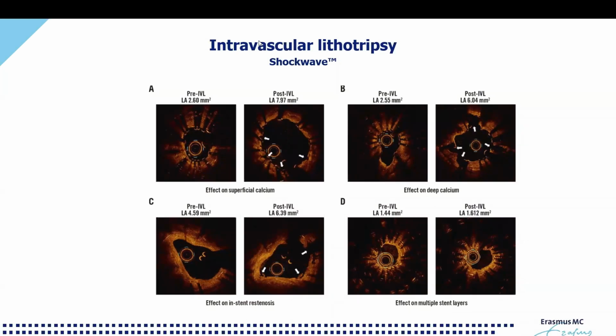We thought that in cases with multiple stent layers it would have been less efficacious, and that appeared to be the case indeed, but not that strong. If you go to the next slide, I can show that.